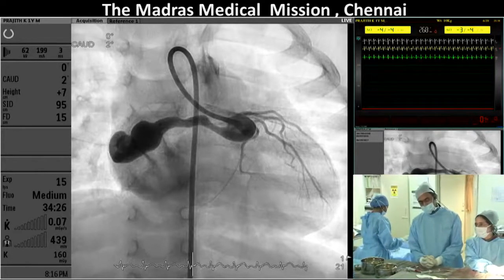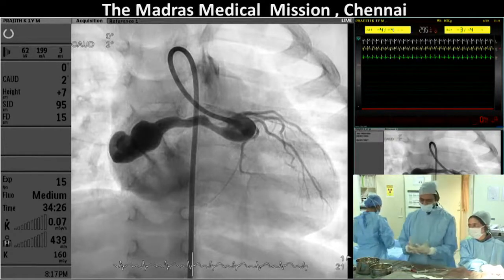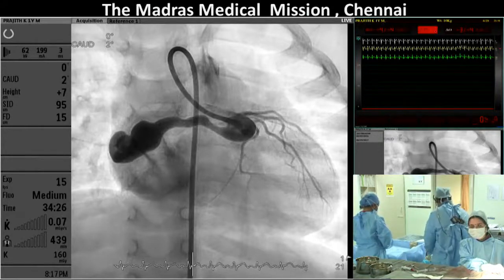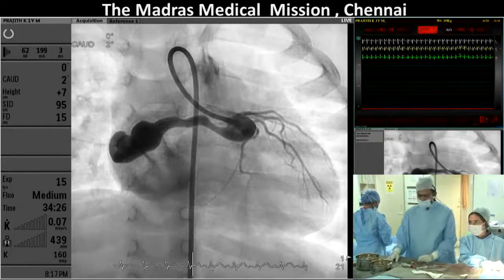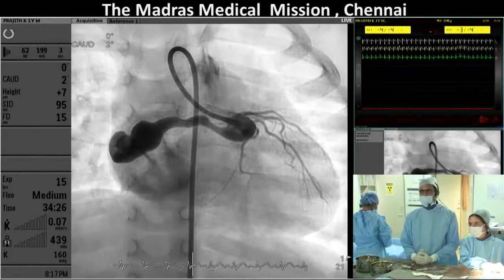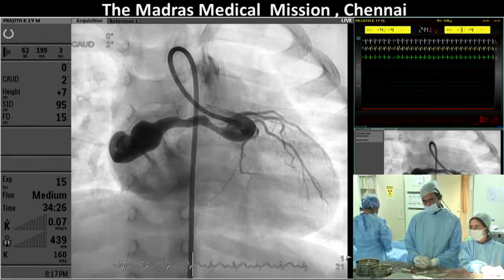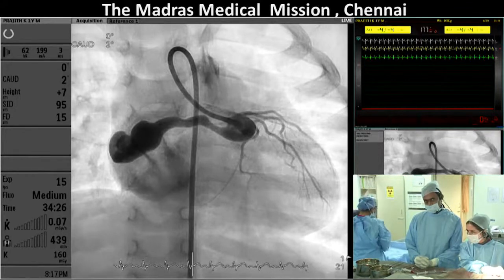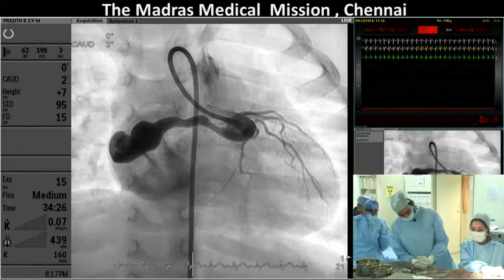I'm sorry, but I will probably send this patient for surgical closure. At this point, Jim's suggestion brings me the fear that the coils will float there a lot, and then it will thrombose the whole system. So that sinoatrial artery will have the risk of also getting thrombosed. Well, I will discuss that a little bit later. I cannot find any evidence that surgical closure of one of these fistulas is less likely to result in thrombotic propagation than catheter closure.